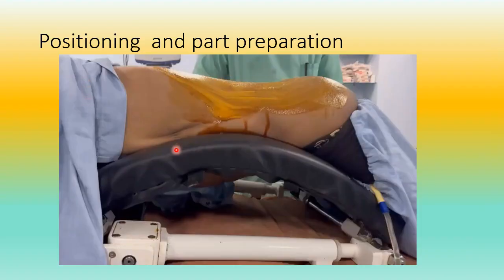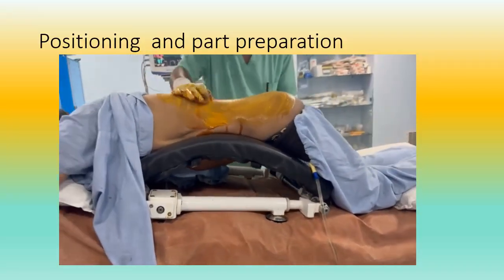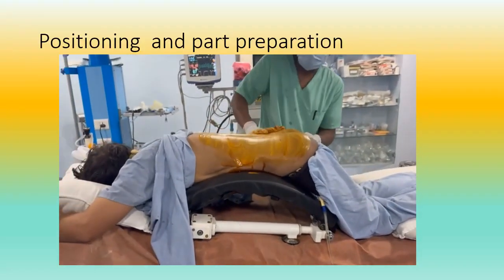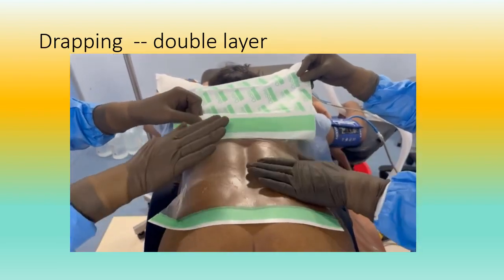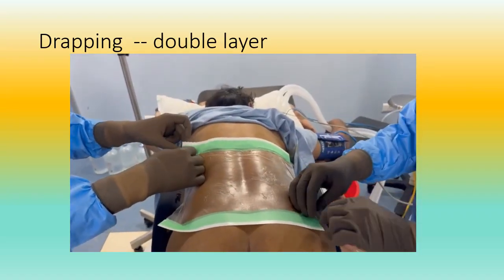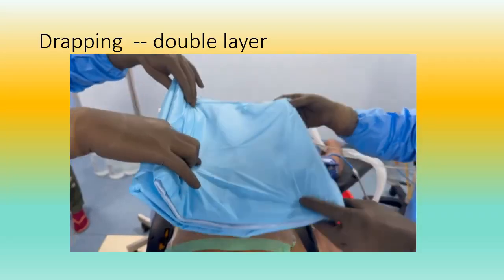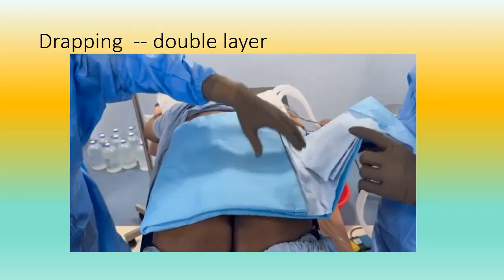Serial dilator. This is the position, Wilson frame. This is the patient lying, abdomen is free, and wide preparation is done. Then double draping. First draping, we apply tincture also so that fluid does not soil the patient body and cause hypothermia. It has to be done. And the second layer, panel drape, is applied over this adhesive draping.